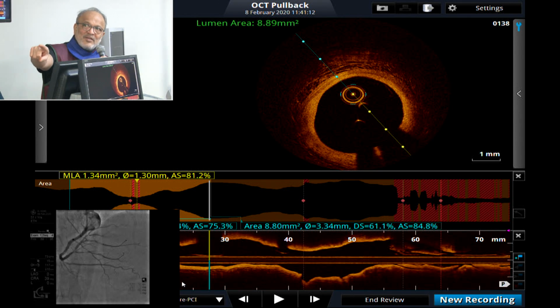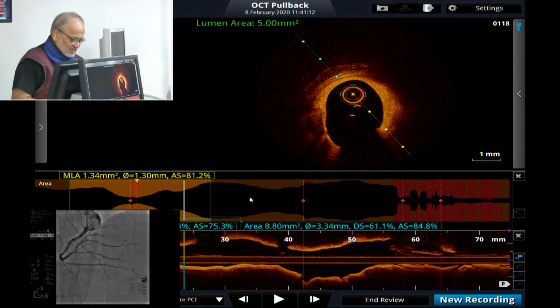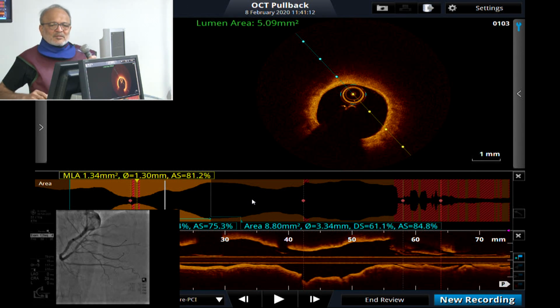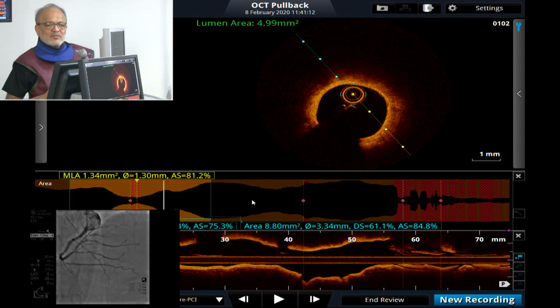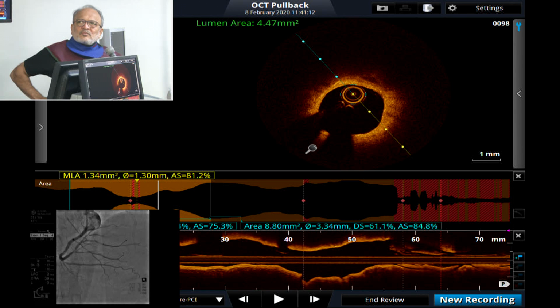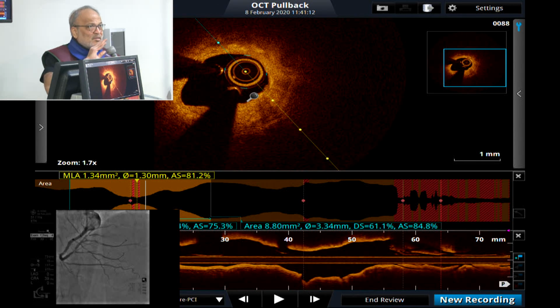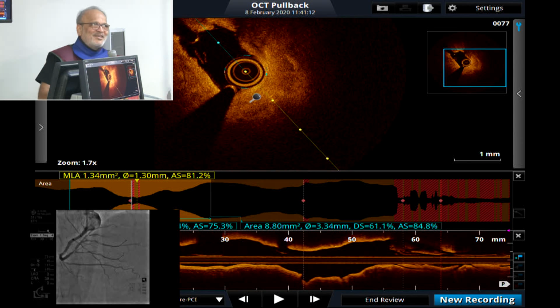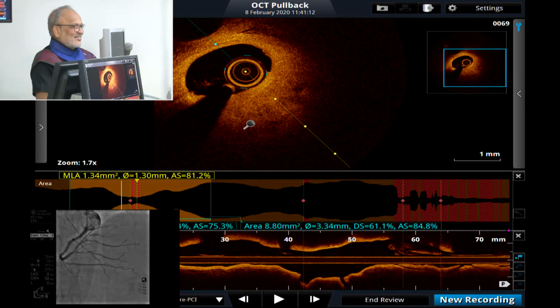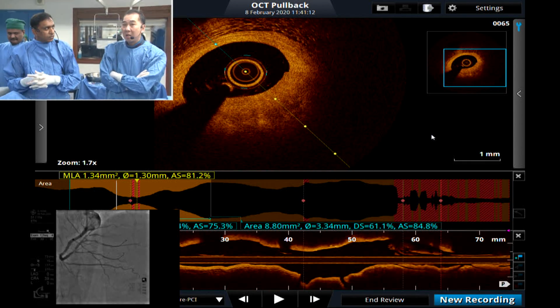Because that will mess up the result of the main artery. Actually, I also agree with you. I just wanted to ask the question because this is something that our beginners who are starting with complex lesions should also remember: just seeing a plaque, especially with beautiful images, we don't really need to change our strategy. One should develop an attitude of selective blindness. You should not see some things, and then you will be happy. Okay, so I decided to still do the provisional stenting technique. In this case, I think most panelists agree, right?